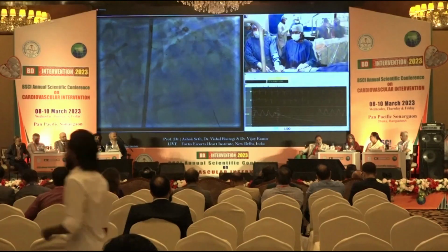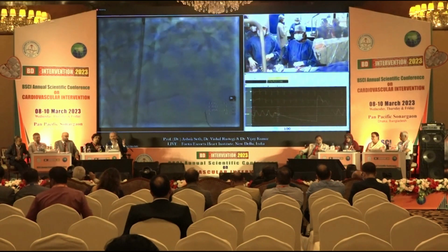So, sir, you are in the middle of the battle. Yeah, normally I position it slightly eccentric. You see that marker, that first marker should be at the point of maximum calcification. Go on. That's right. And that's where it is. Dr. Sheth, that's where I'm delivering it.